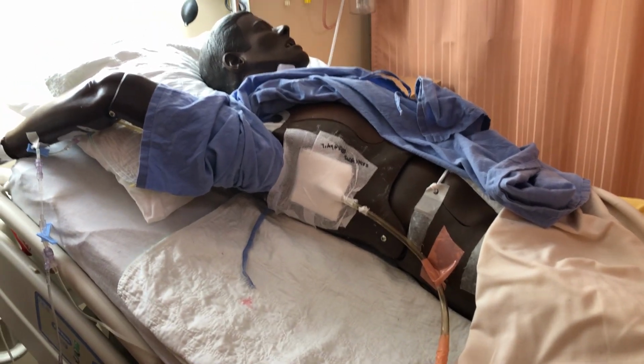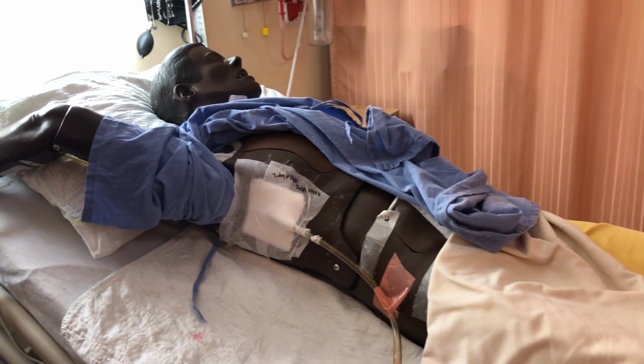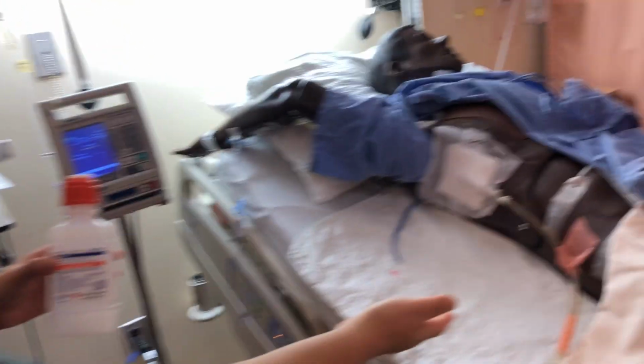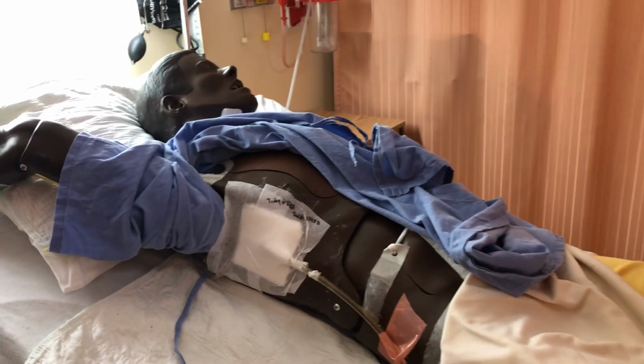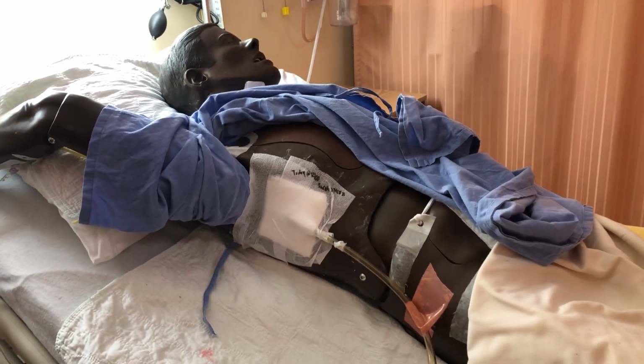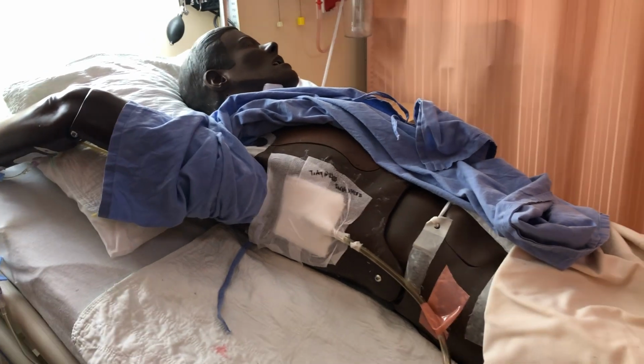So now I'm going to check why the bubbling is occurring. Also, just part of my safety check, I would also have sterile water here, just in case the tube was to disconnect, I could attach it. So I'll keep this at the bedside. I would also, if the tube was to dislodge, I have gauze and dressings here. Gauze, dressings, and tape to create a 3-sided dressing.